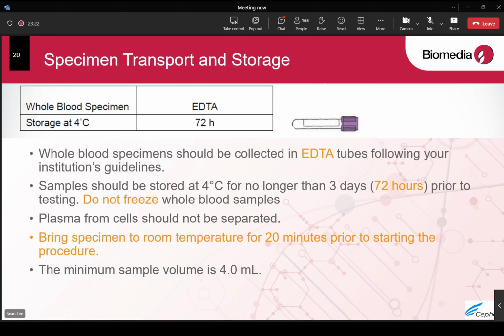It will help to maintain the integrity of the DNA in the samples. Of course, it's not necessary, because DNA is quite stable at room temp, but we do not know what happens during the logistics. Maybe the temperature during logistics can reach more than 35 degrees Celsius. So we try to minimize the impact on the DNA integrity. So it's best to put some ice packs to keep the blood samples.